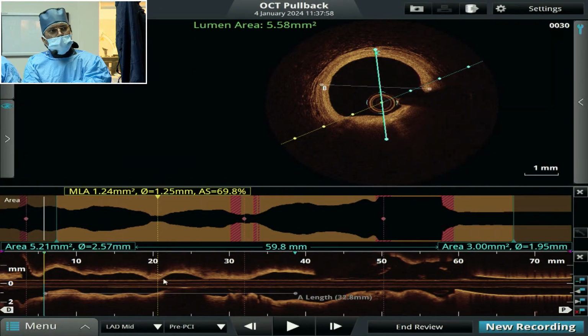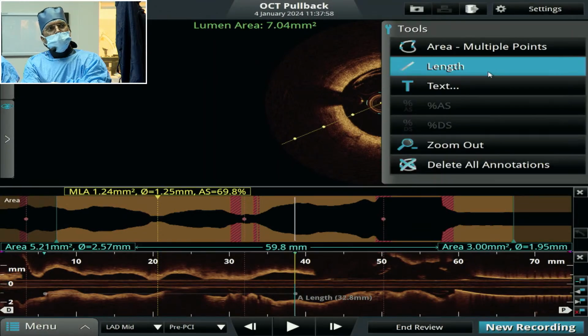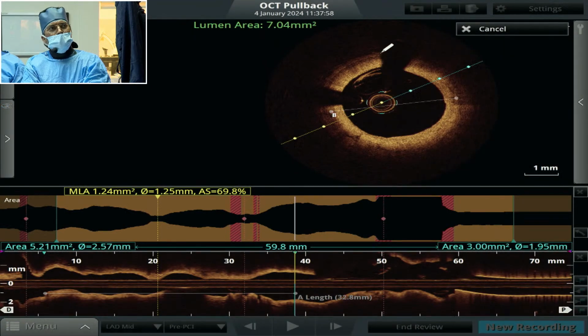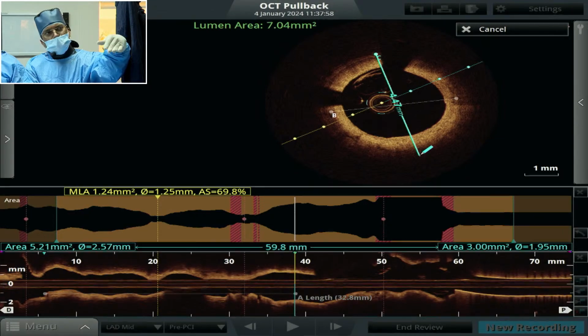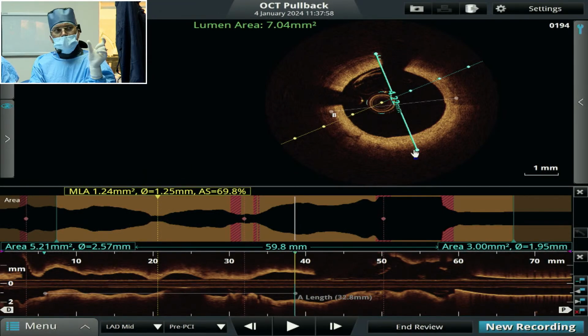Come to the proximal landing zone, there you take the EEL diameter, slightly away, almost it is coming to 3.8, vertically also you take, from there outside that black, still you have to move it down. Now slightly away, almost 4, so roughly proximally 4 mm diameter. So, we are going to choose the 3.5 mm diameter stent, 33 mm length based upon the OCT parameters.